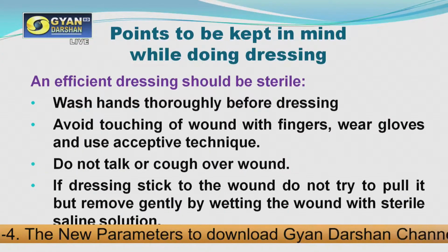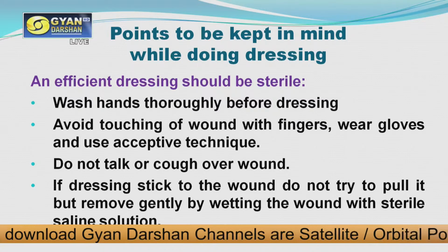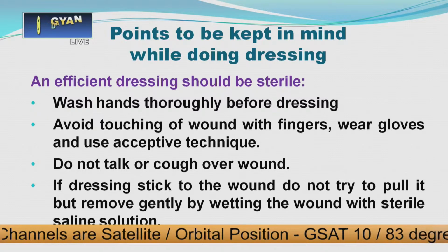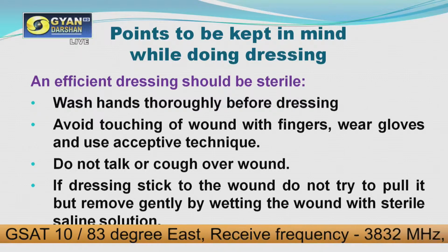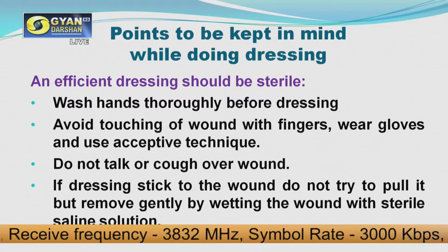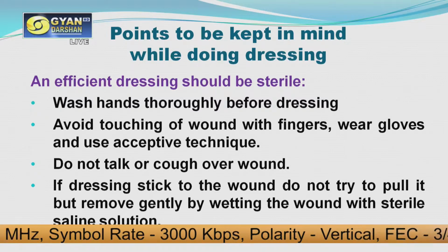Now let us see the points to be kept in mind while doing the dressing. An efficient dressing should be done. You have to maintain the aseptic technique, so it should be sterile in whatever condition, and you need to wash your hands thoroughly before the dressing. Avoid touching the wound with your fingers.